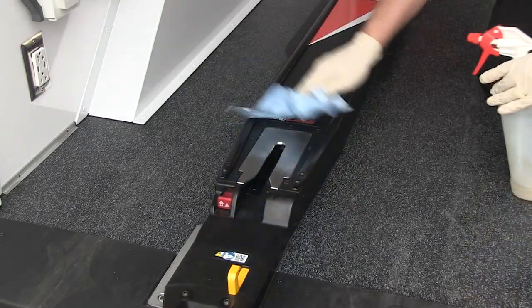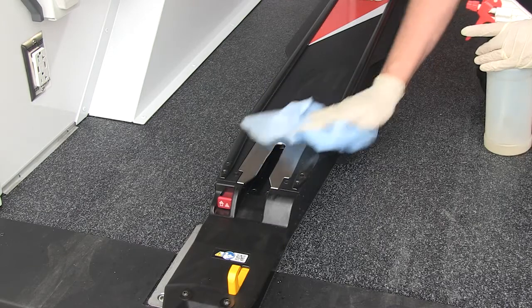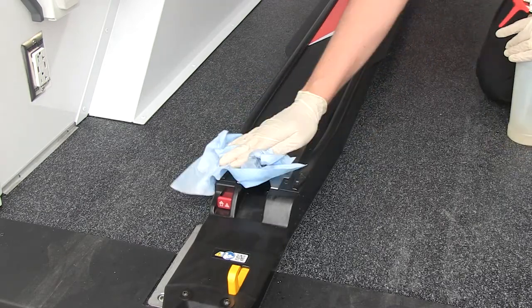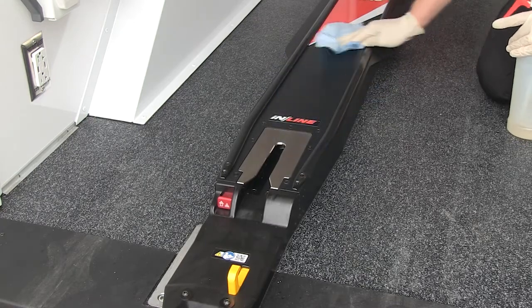When cleaning the inline fastening system, hand clean all surfaces with warm water and a mild detergent. Rinse with warm, clear water. Dry the fastening system with a towel or allow it to air dry.